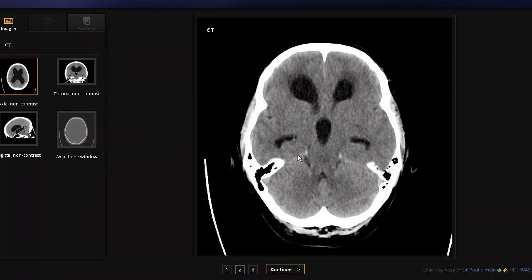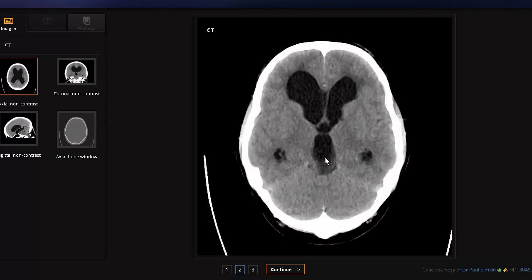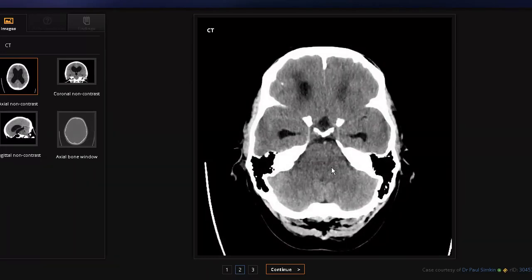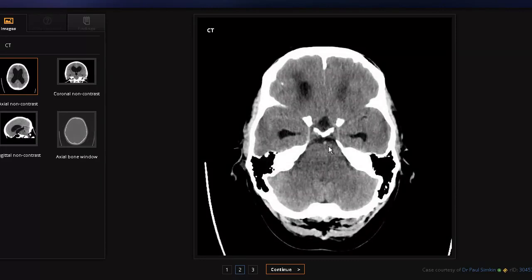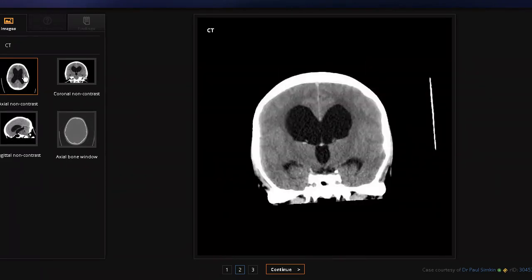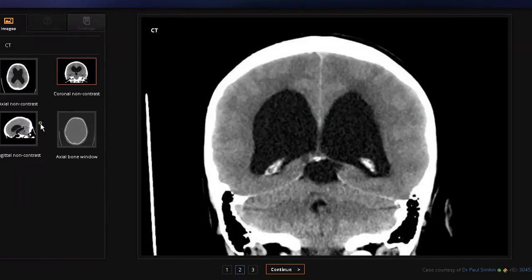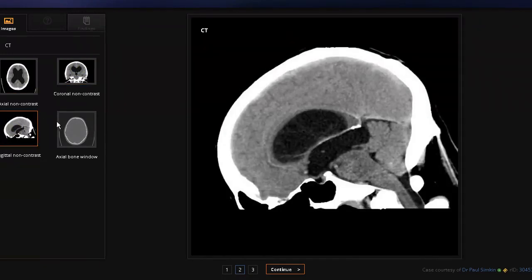You can see a very nice midbrain right here, with the superior colliculi visible. Going even further down, the cerebral aqueduct would be narrow because it is located right at this junction between the brainstem and cerebellum. Between the cerebellum and the brainstem, everything is normal in the cerebral aqueduct and fourth ventricle. This is basically how you can identify these findings on CT. Hydrocephalus is usually congenital, but it can be acquired due to injuries or infections.